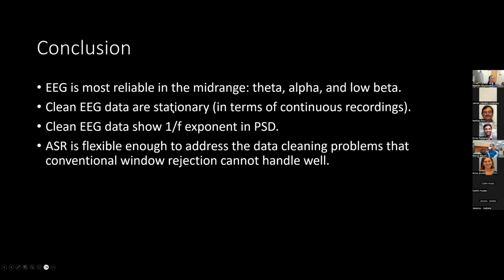And it's also a good thing to remember the definition of stationarity. Although there is no unitary definition, and there are multiple methods to evaluate stationarity, stationarity is a good concept to stick to when we talk about preprocessing. And 1/fness, again, with the skepticism by Paul Nunez, generally speaking, if the power spectrum density goes against this 1/f, then that's absolutely not from the brain. So those empirical criteria are always useful.